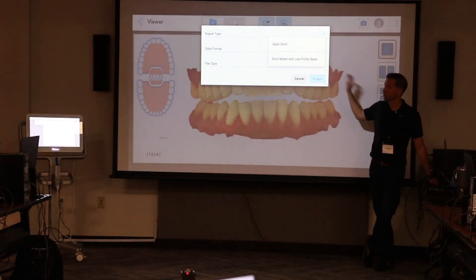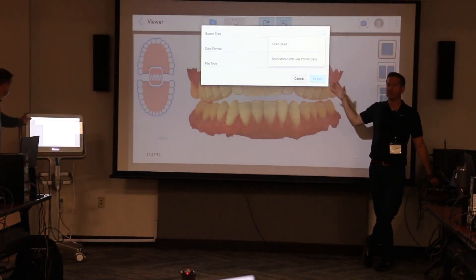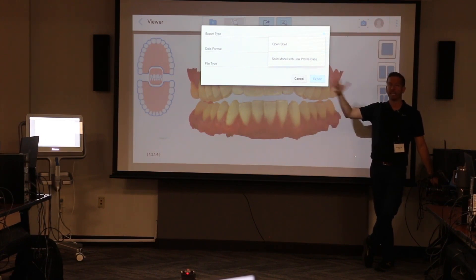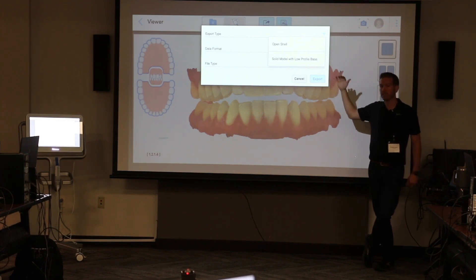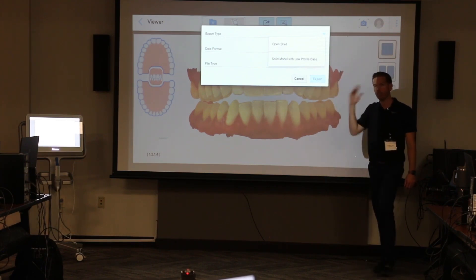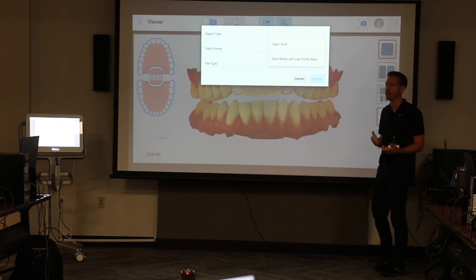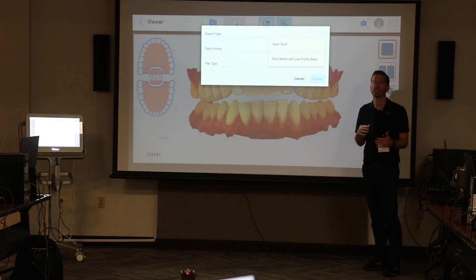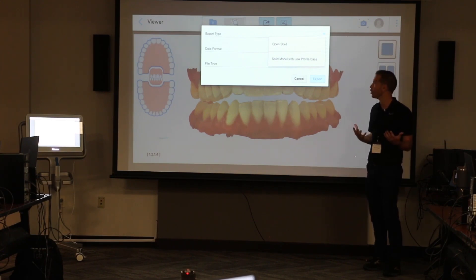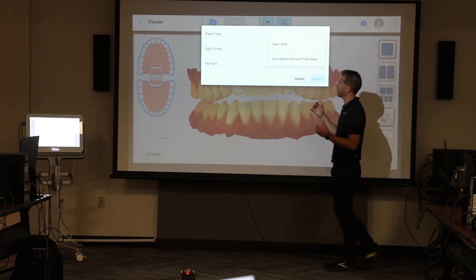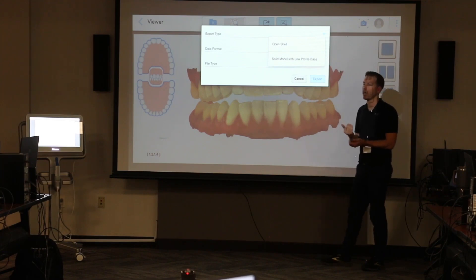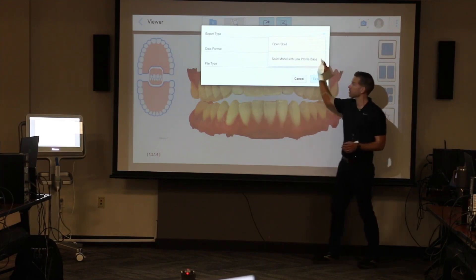We need to get these files off this machine and into our ecosystem. This is how we're going to get those STLs off. If you have an iTero, this is the workflow. Other scanners will have their own mechanisms. iTero is really cool because you just open your web browser, type myitero.com, browse those files, and there's a button called Export — that's how we take an STL off that site.